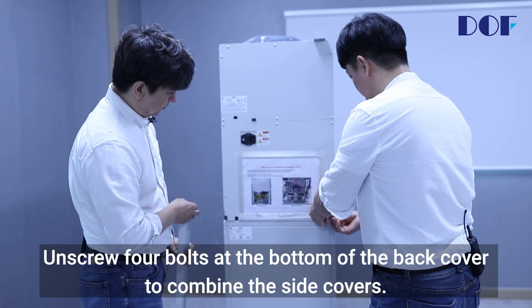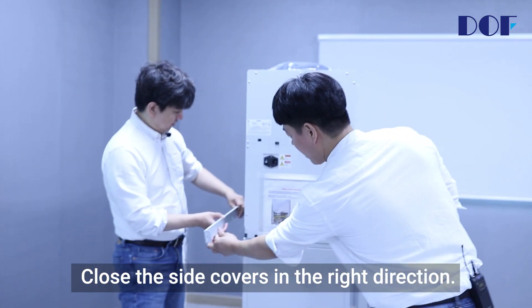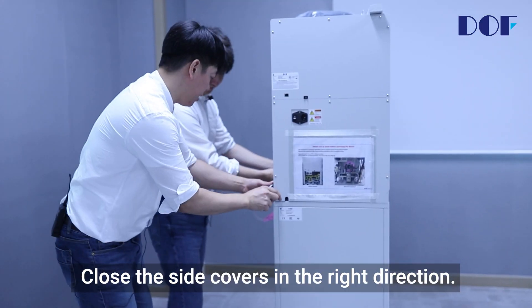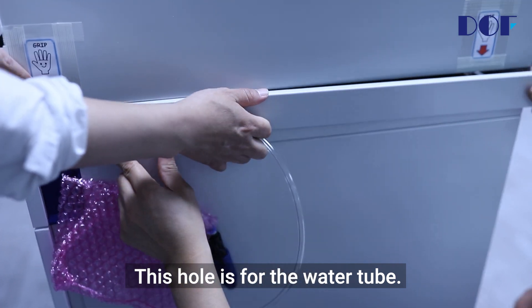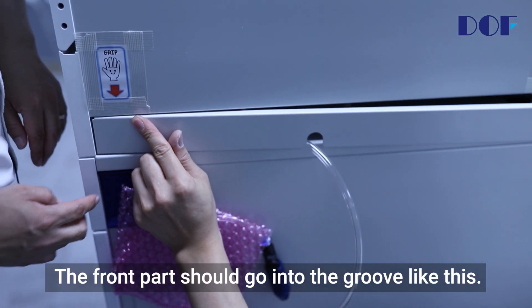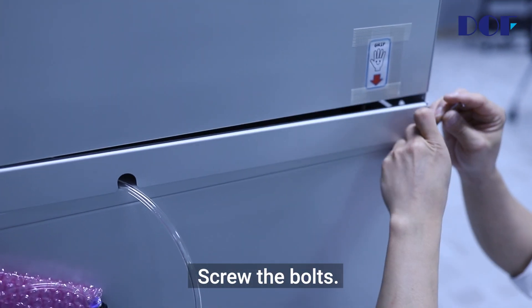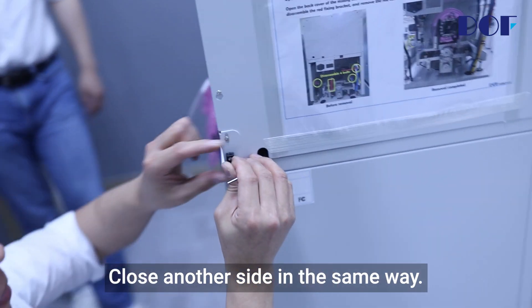Unscrew four bolts at the bottom of the back cover to combine the side covers. Close the side covers in the right direction. This hole is for the water tube. The front part should go into the groove like this. Screw the bolts. Close the other side in the same way.